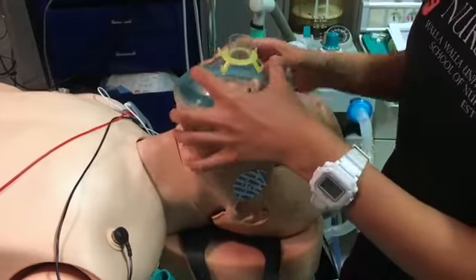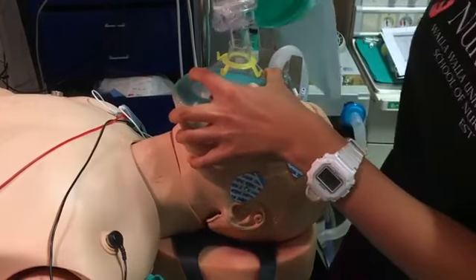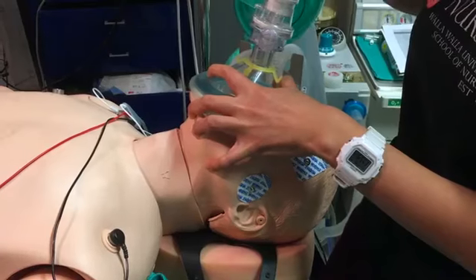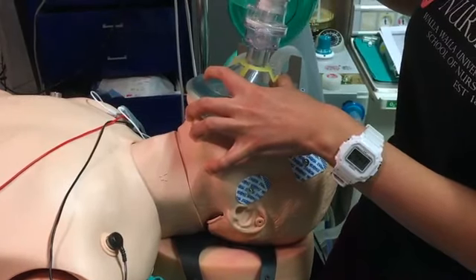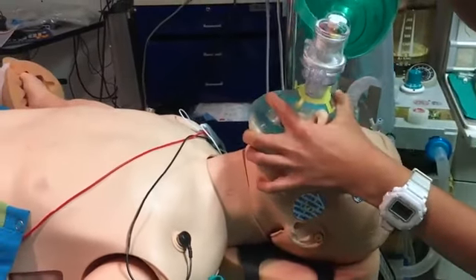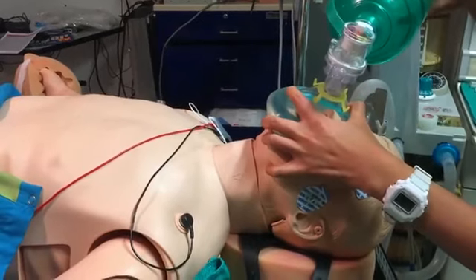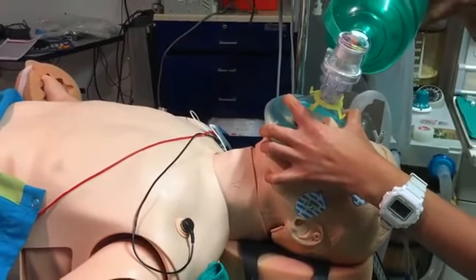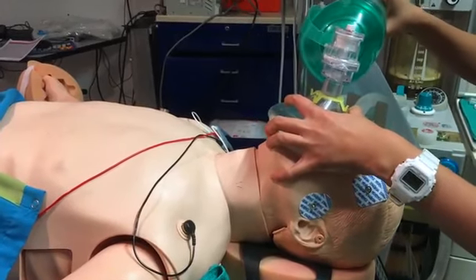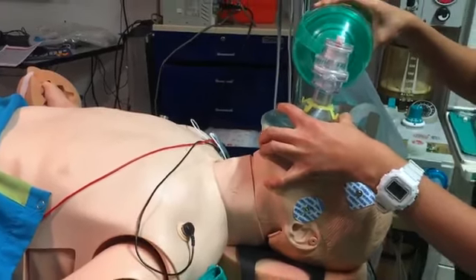And then of course, if you have an appropriate seal, you can assess if you're masking well by checking for chest rise and hearing if there's a leak. If there's a leak, for the C part of the EC clamp position, you should always go towards where the leak is. So if, for example, there's a leak that I hear on the right side of the mask, I want to lean it towards the right side and then be able to mask the patient. And that's how you properly mask somebody.